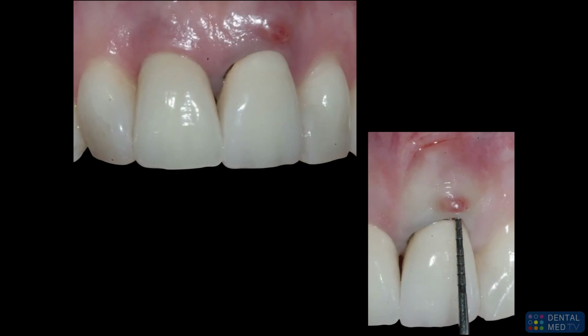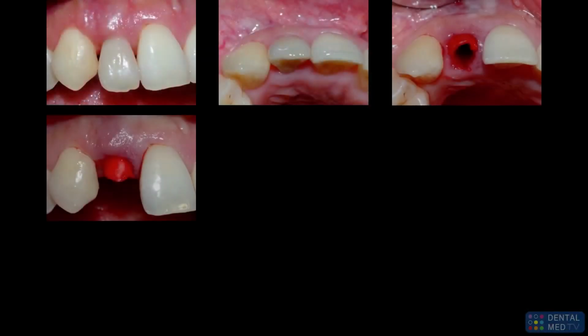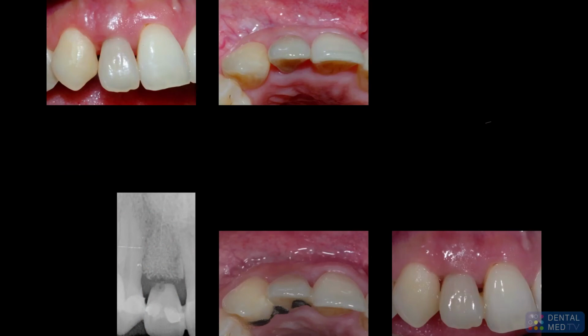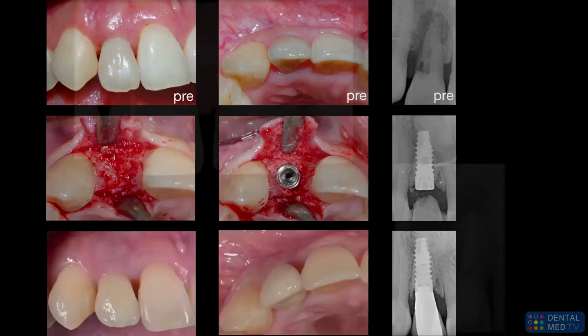It's really important to probe the buccal aspect of the tooth that has to be extracted, because a probing depth of more than 4 millimeters, as Chen demonstrated, probably corresponds to a loss of the buccal bone plate. In those cases, a socket preservation procedure is indicated: extracting the tooth with a flapless procedure, then placing biomaterials in the socket and some collagen on top, and using again the pontic to maintain the soft tissue profile. This allows some months of bone healing, then placing an implant in a proper aesthetic position and restoring it with nice results.